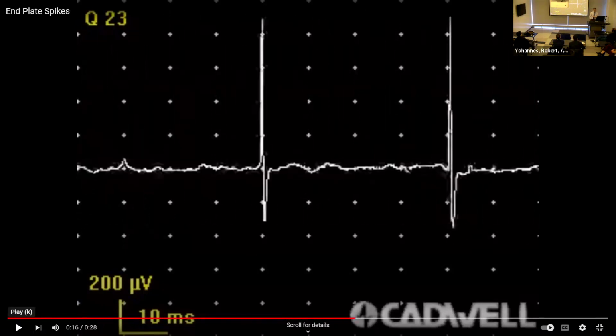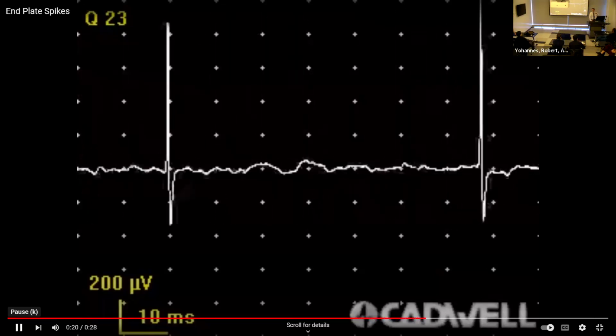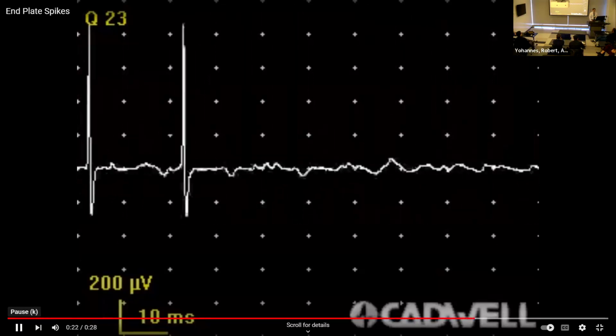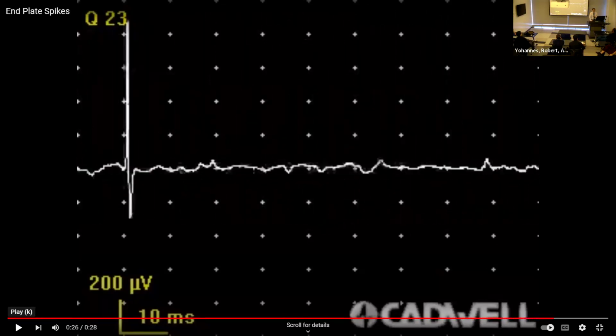You can also think of this hum as those large seashells that, as kids, you put on the ear and hear this kind of hum. That's also a description. So listen to that, the rumble in the back. This hum should not be there. If it's static, those are the spikes.